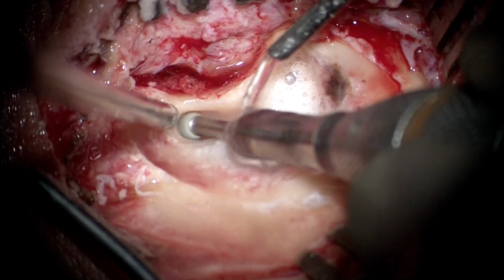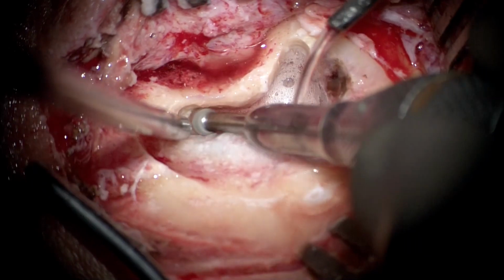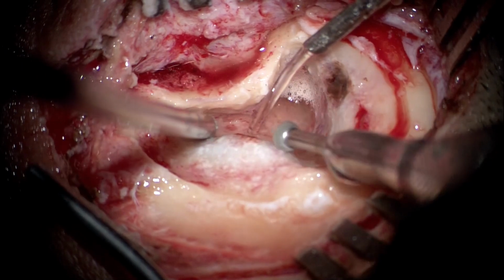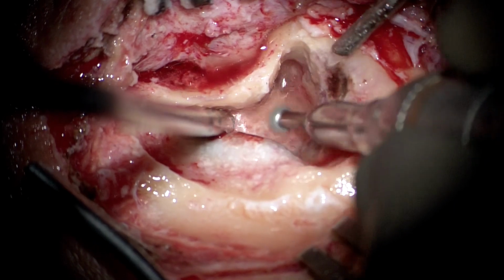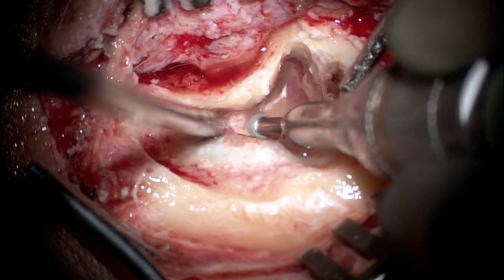So the amount of bone that has to be drilled here inferiorly between the posterior canal wall and below the sigmoid sinus will depend on the amount of decompression that is so desired. The more the amount of decompression one desires of the sigmoid sinus for overall vision, the more the bone around the sinus, especially posteriorly and inferiorly, which has to be drilled.